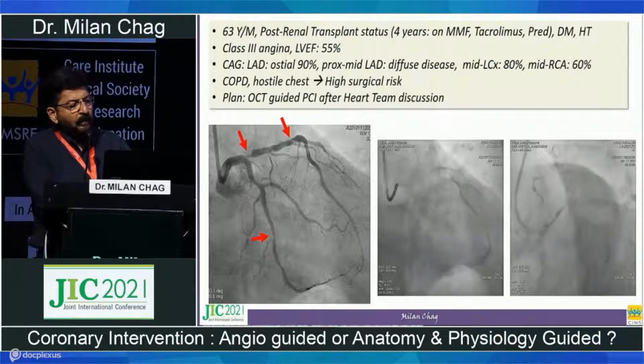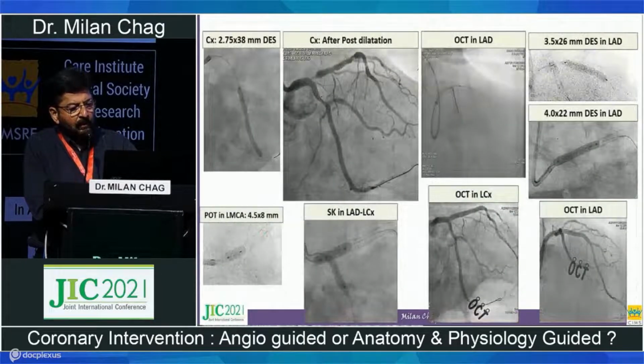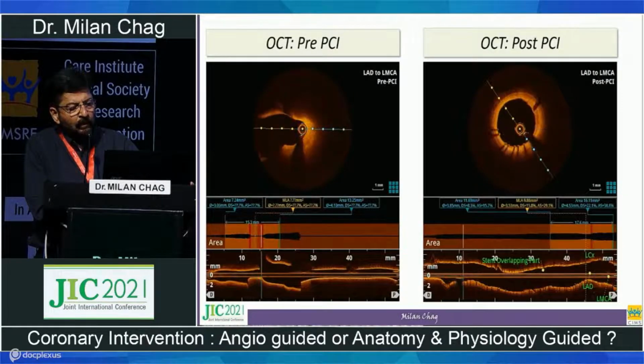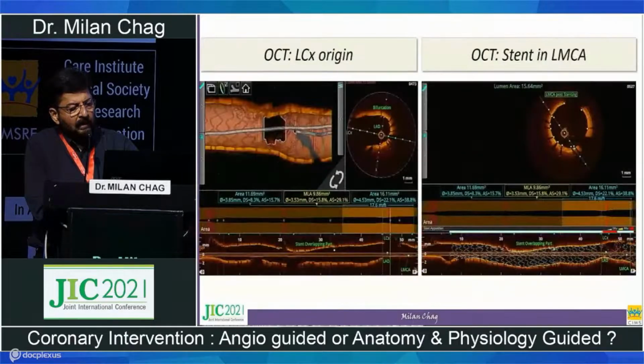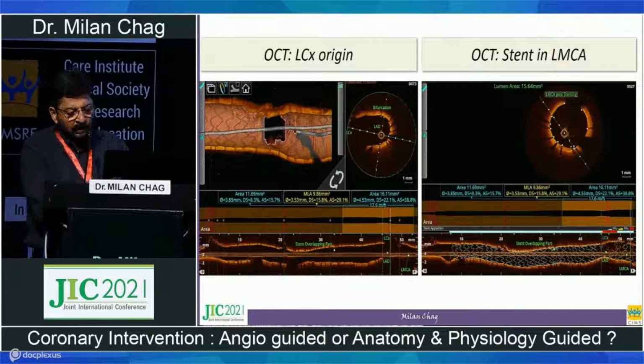You have to do left main plasty here. If you want to do that, you have to give stent-like results. Did OCT guided PTCA. Reconfirm that everything is fine because you are treating left main bifurcation. And then you can see that when you put stent across left main to LAD, circumflex ostium should remain open. And this is what is demonstrated here nicely.